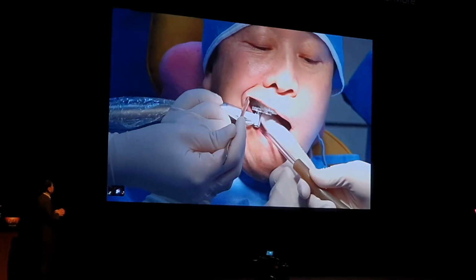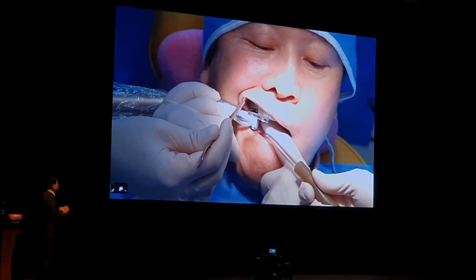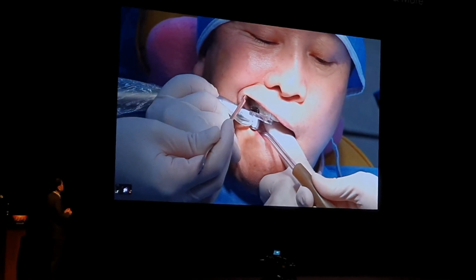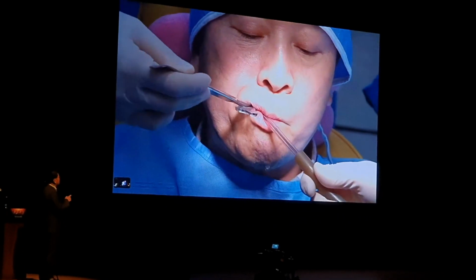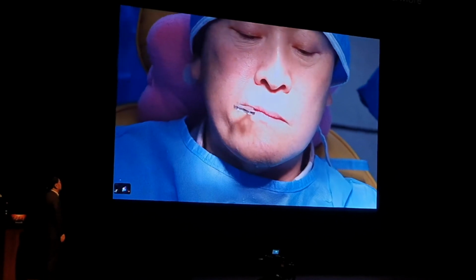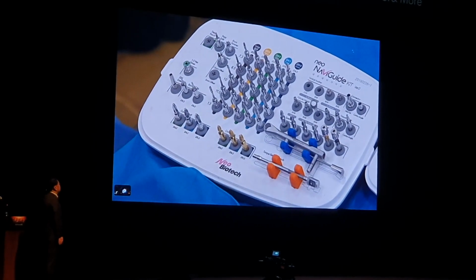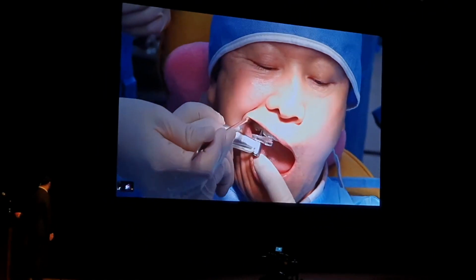It has an offset of 12 millimeter, which means it should be drilled up to the first graduation, the marking on the Neonavi kit. Among the three markings, it should be drilled up to the highest marking, bone planar. After using the tissue punch, he is using the bone planar with a 3 millimeter offset.